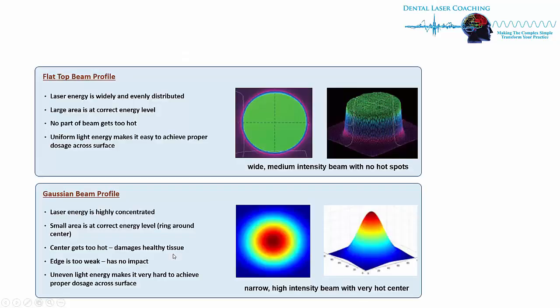And now what's important is when we start talking about pulsing the laser, it becomes harder and harder to make that energy consistent. In other words, when you're turning it on and off, you want it on for that amount of time and then off. And that's called flat top beam profile. That's very hard to do and expensive.